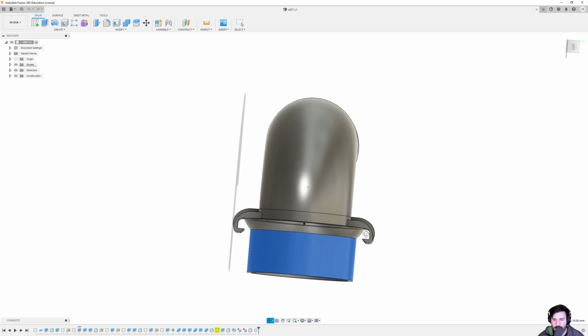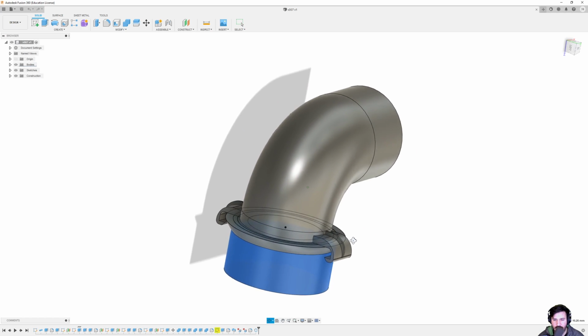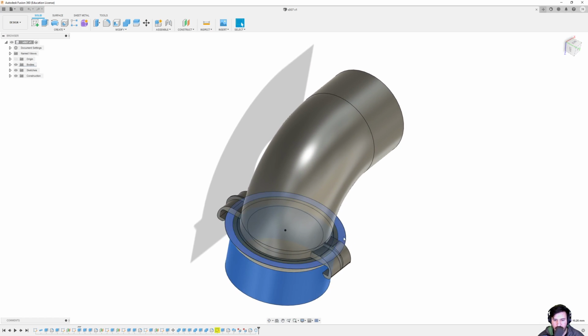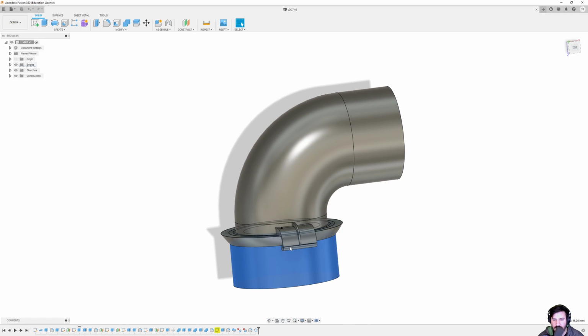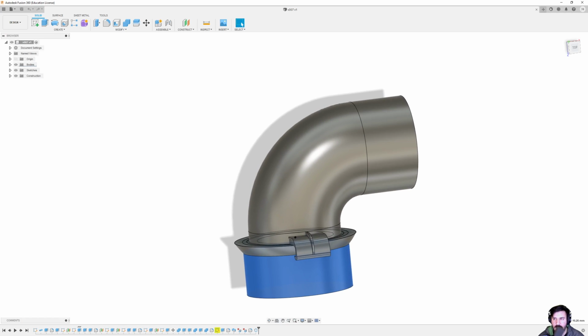And so what ended up happening with that is, because of the way the 3D printer prints, where it does layers, either left or right or up or down, depending on how you print it, it actually made this quite a bit weaker. So where this line is, every single layer would be a line like that, which would be a weakness, because that's a point where plastic is only melted together, you know what I mean? So it's not quite strong.